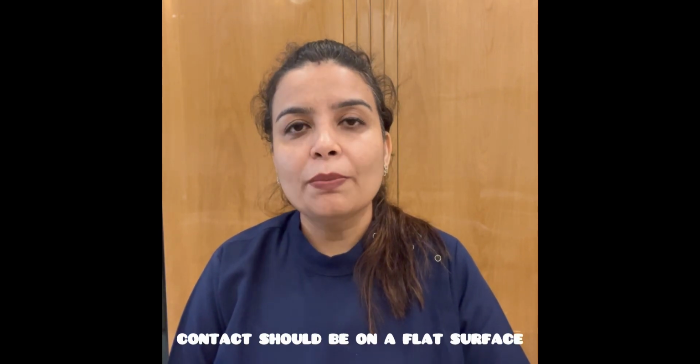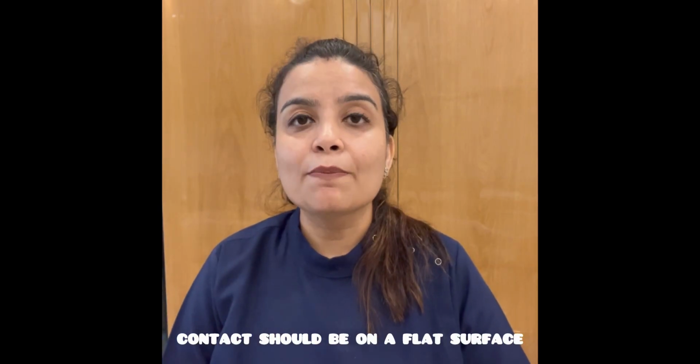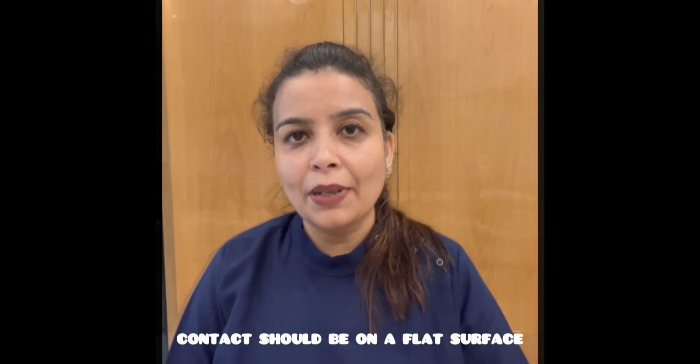The contact should be on a flat surface that is perpendicular to the long axis of the implant. This can be done by identifying the center of a properly angulated implant, creating a 2 to 3 mm wide central fossa that is flat and perpendicular to the long axis of the implant and parallel to the curve of Wilson and Spee. Occlude the opposing cusp directly over this flat central fossa perpendicular to the occlusal plane.